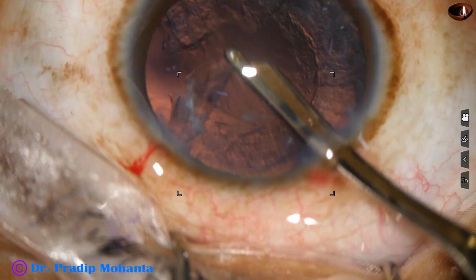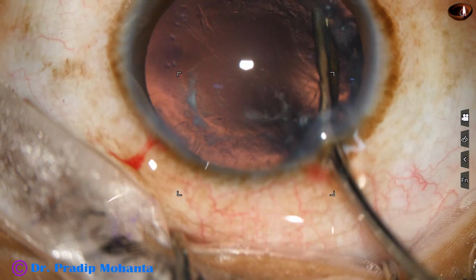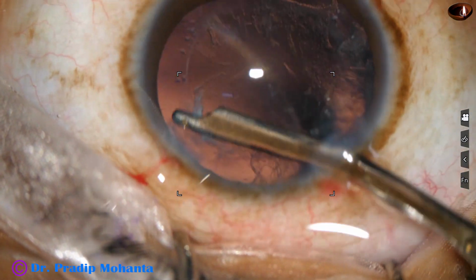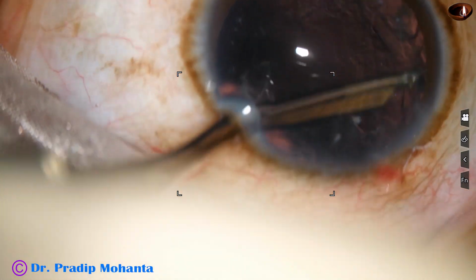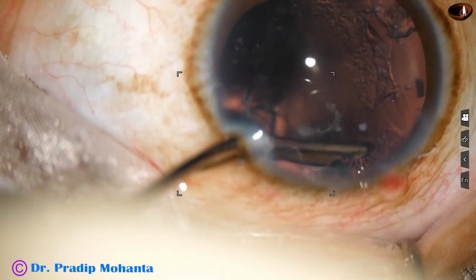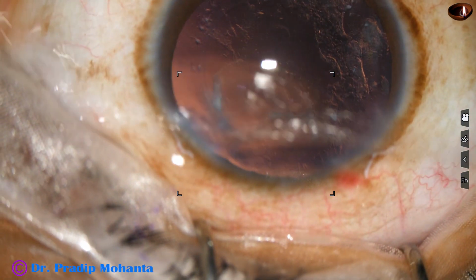And now I remove the cortex very gently. I am using a 23 gauge Simcoe at this moment. I go through the left side port and remove the cortex from the right side from 9 o'clock, 10 o'clock, 12 o'clock.